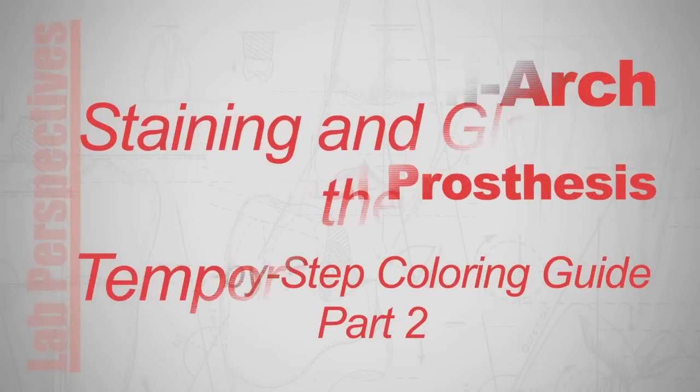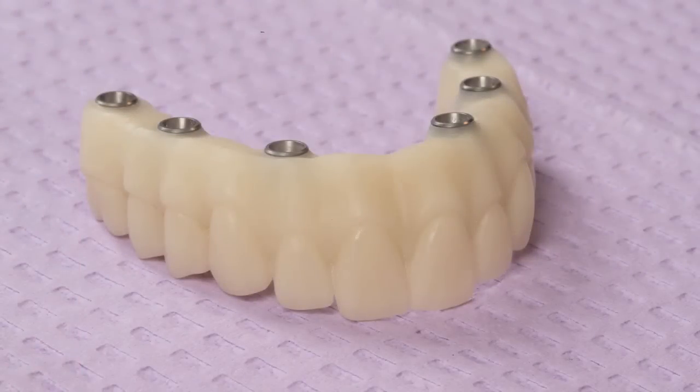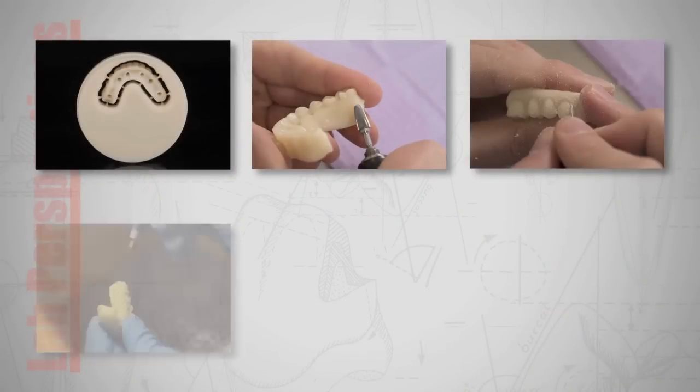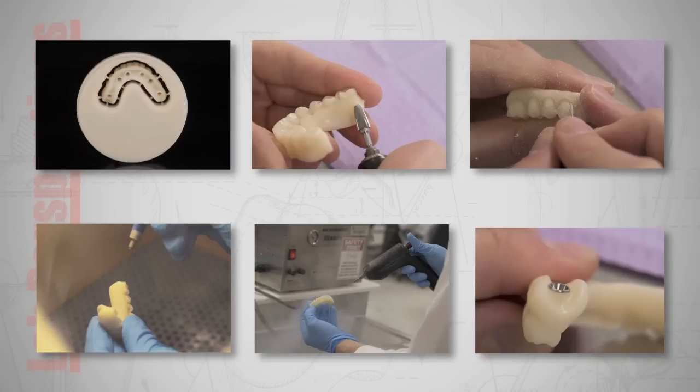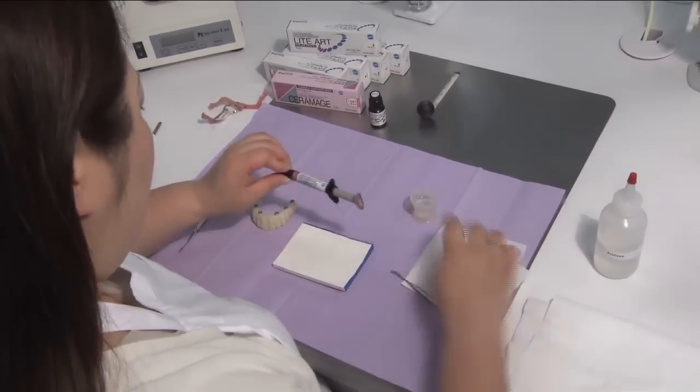This video is the second in a series on the laboratory techniques used to color the BruxZir Full-Arch Provisional Prosthesis. In Part 1, the PMMA appliance was milled, desprued, touched up, sandblasted, steam cleaned, and the metal copings were inserted. Now preparations are made for the staining process.